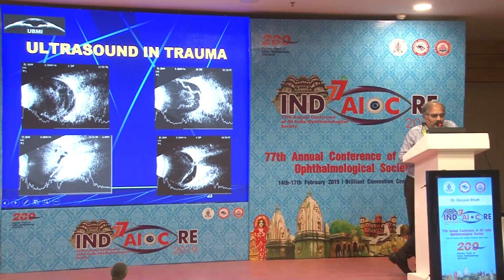Look at those two scenarios. I did the case of trauma ultrasound on day 1. Looks like a vitreous hemorrhage. Doesn't appear to be any RD. The patient came to me after a week's time. The hemorrhage got absorbed and an RD has developed.